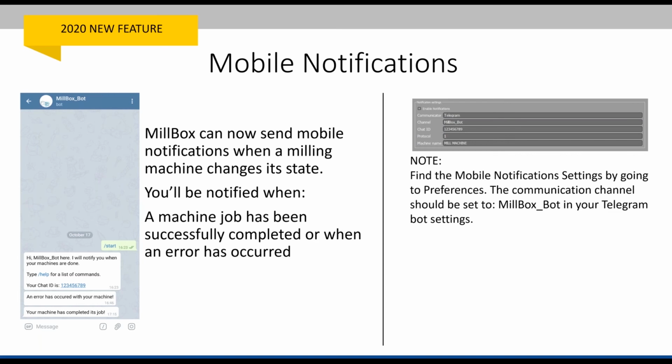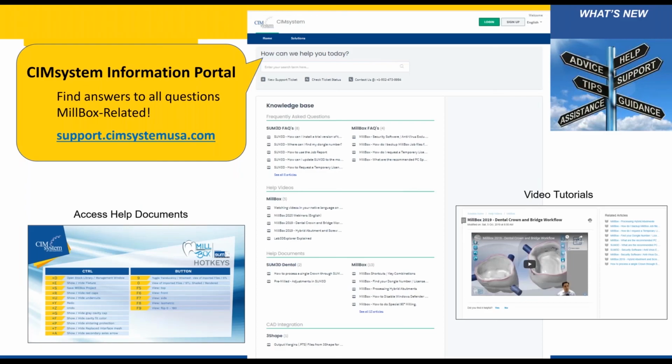Listen, we have a lot of other great features as well. You can set up a camera and do a machine live view to really, really see what's going on with the machine, to see what state it's in. The 90-degree milling I mentioned. If you're not doing 90-degree milling and doing that targeted machining on some of those fine areas, I don't want you to miss out on that anymore, because a lot of labs are taking advantage of that, and they're doing really well.